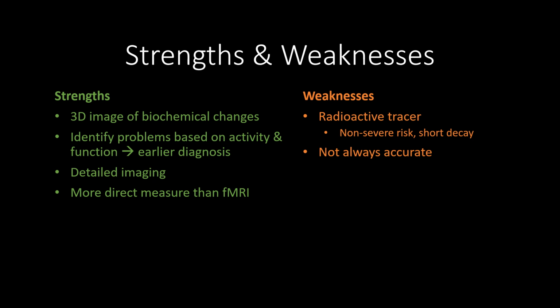High levels of blood sugar can also cause the cells to absorb this normal sugar rather than the radioactive injected kind. Patients are usually fasted for 4 hours before a PET scan, and blood sugar levels are measured to lower the chances of this happening. PET scans are also a very expensive form of imaging and are not readily available. They often accompany other scans, such as CT and MRI, in order to be diagnostically effective.